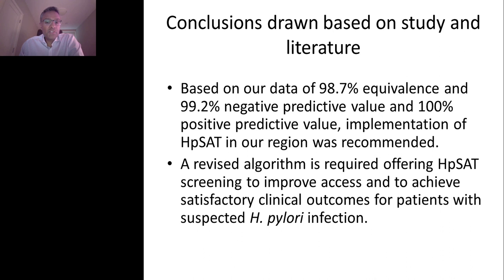in our region was recommended, especially in view of the wait times that were required to obtain a urea breath test. Furthermore, a revised algorithm was required in order to advocate for the stool antigen test to improve the access and achieve satisfactory clinical outcomes.